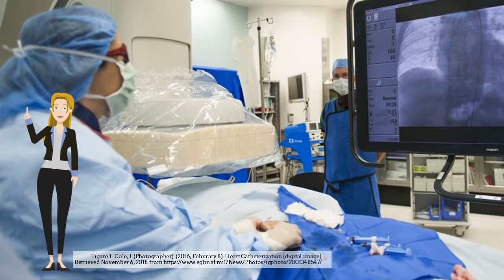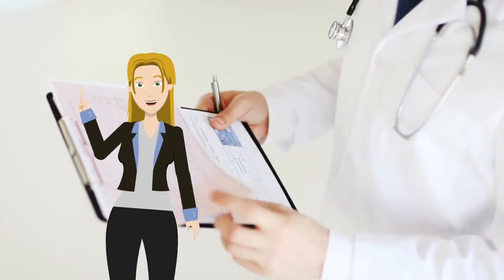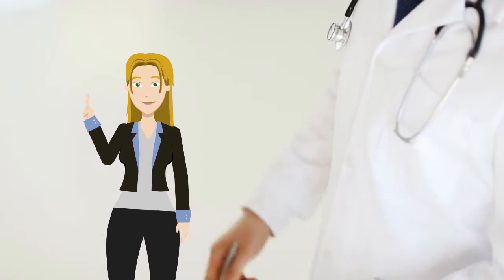Cardiac catheterization is a procedure done to evaluate your heart by inserting a small catheter into a large blood vessel that leads to the heart and using X-ray images to visualize the arteries, heart valves, and chambers. There are three major reasons for your doctor to decide it is medically necessary to perform a cardiac catheterization, in an attempt to understand how your heart is working, or why you're having chest pain, for example.